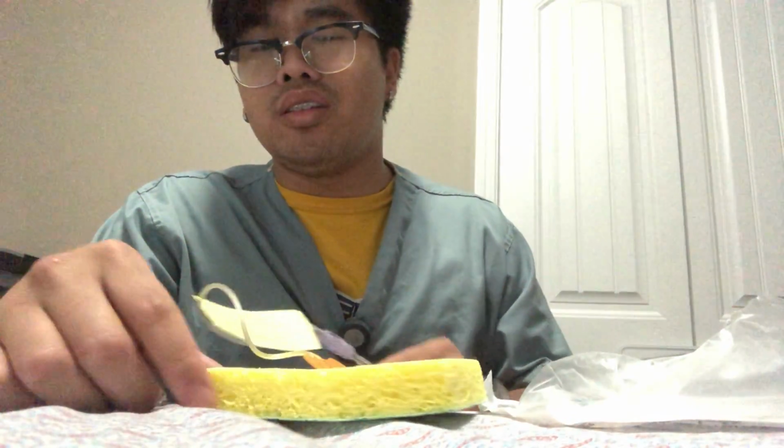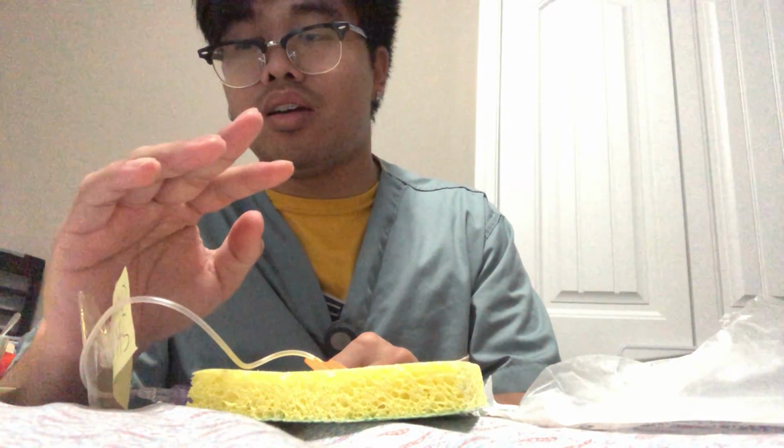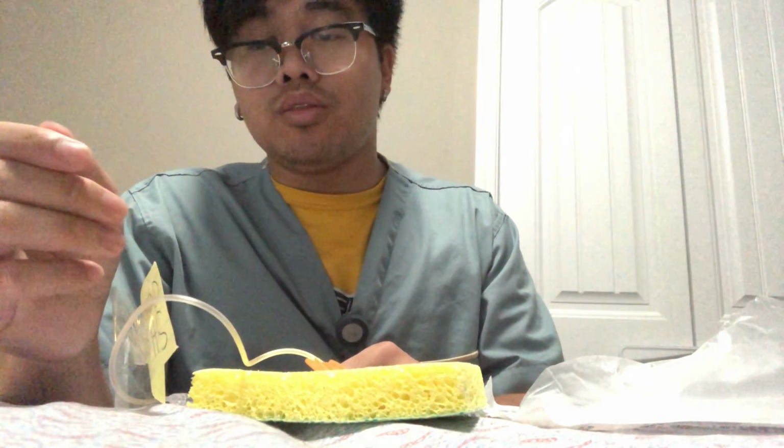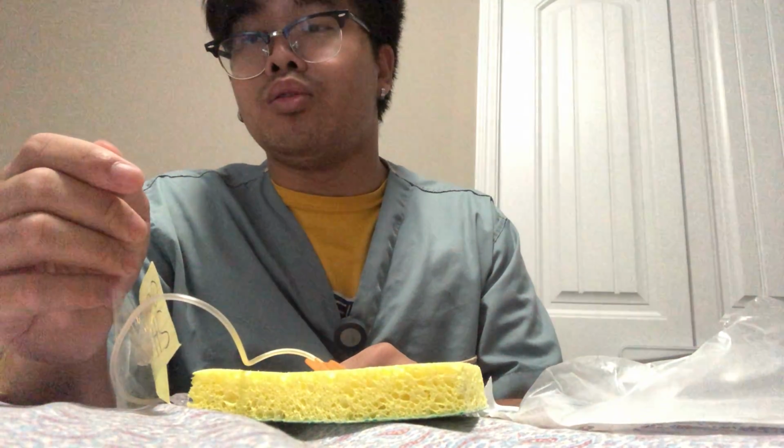And then once I've done that, I'm gonna tell Mr. Square that I will be right back, and I'll be doing his evaluation and post assessment, and I'm gonna recheck on how he feels, and also I'm checking the needle if there's any blood return on it. If there is, I have to redo everything with entirely new supplies, and then that should be it. And then I would go out to chart and document and that's it.